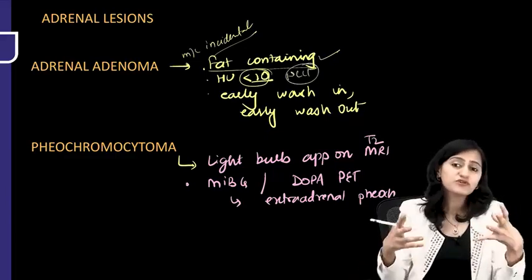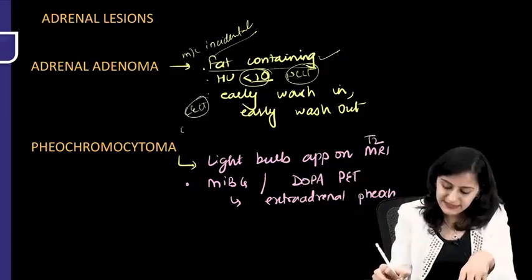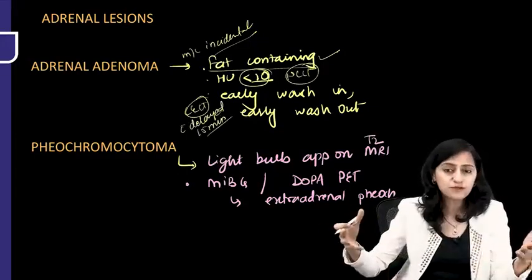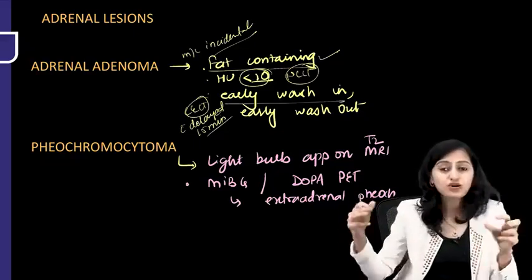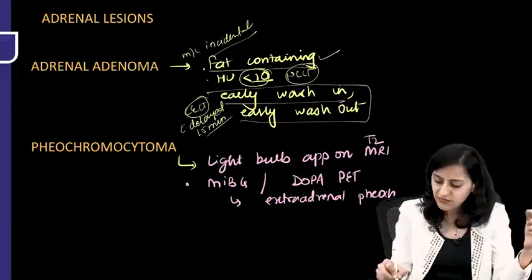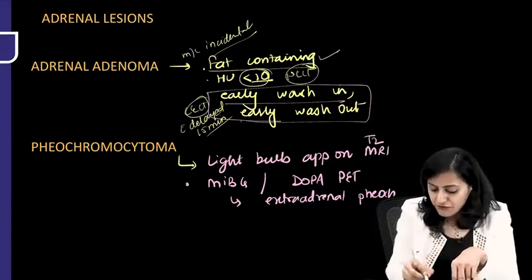But suppose if you don't see that and you want to confirm it's adrenal adenoma, then we do a contrast enhanced CT with a delayed scan taken after 15 minutes to look for the washout. And in adrenal adenoma, a previously asked question, it shows the early wash-in and the early washout of the contrast. So remember, it shows early wash-in, early washout of the contrast.